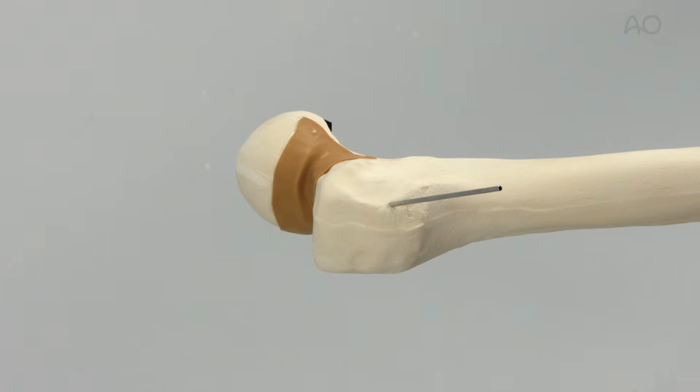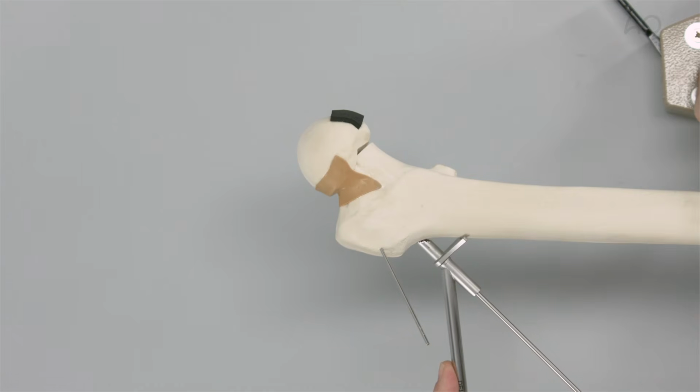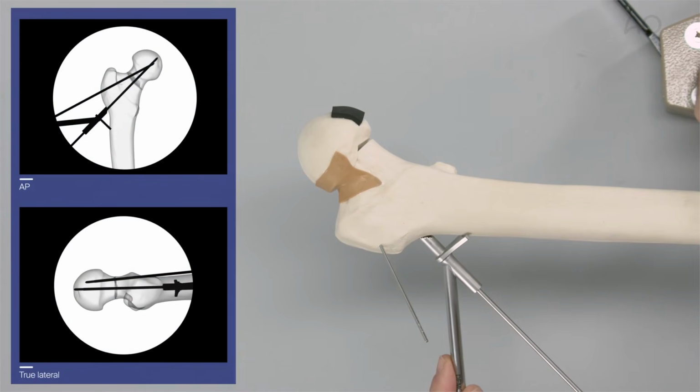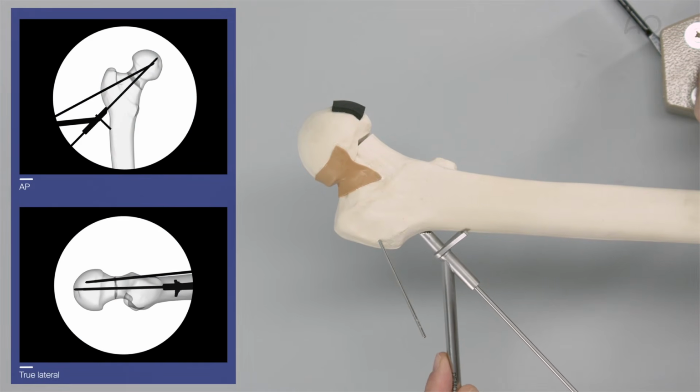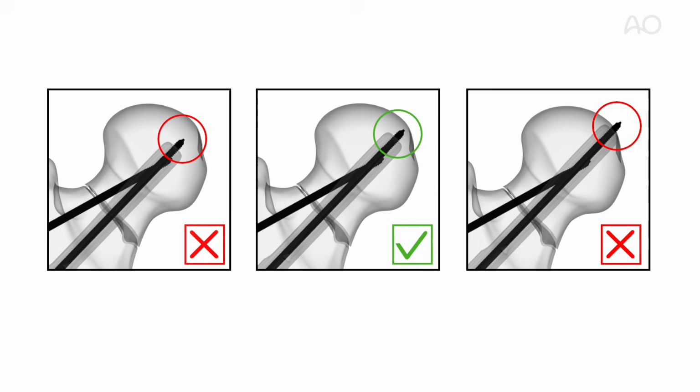The central guide wire is inserted using the 130-degree angled guide into the subchondral bone, ensuring that the tip of the wire is slightly inferior to the apex of the femoral head in the AP view and centered in the true lateral view. Clinically, it is confirmed that the guide wire is inserted into the subchondral bone with image intensification.